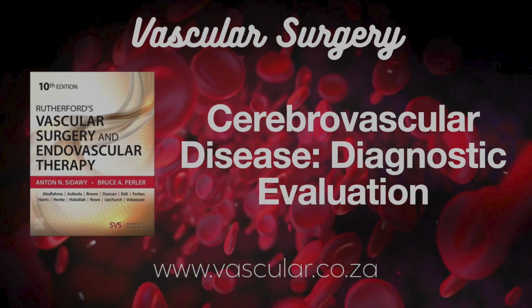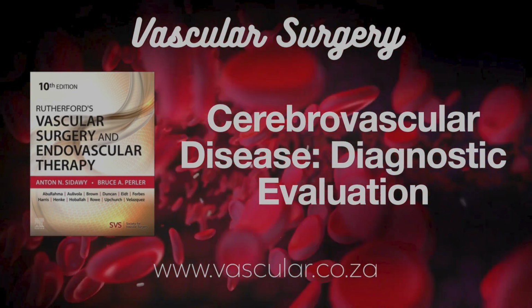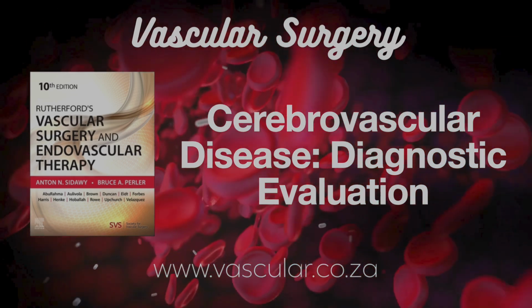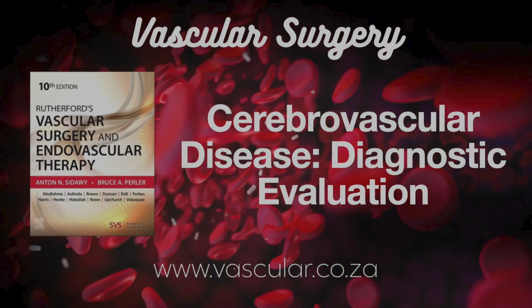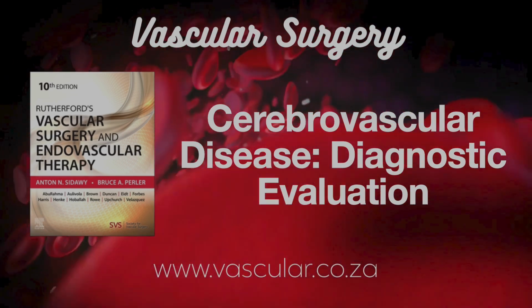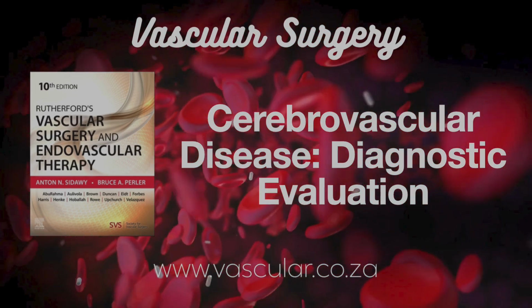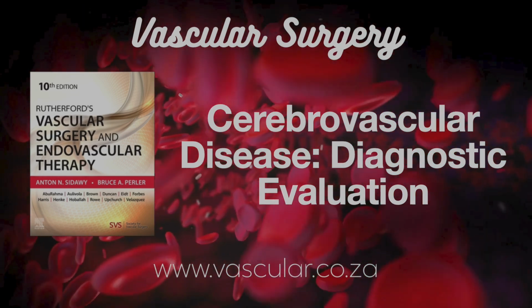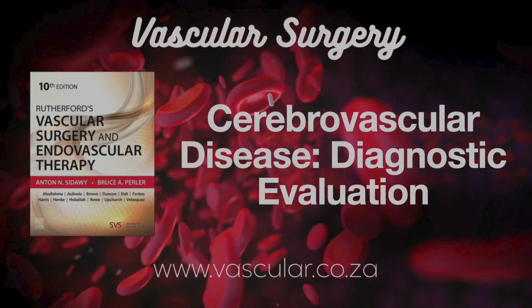Okay, very useful. But what are the downsides, the limitations of CTA? Main things are you need that intravenous contrast dye, which carries a small risk, especially for kidney function in people who already have kidney issues. Contrast nephropathy. Right. Also, unlike Doppler ultrasound, CTA doesn't directly tell you about the direction of blood flow. And there is, of course, some radiation exposure, though, as I said, it's generally low with modern tech.